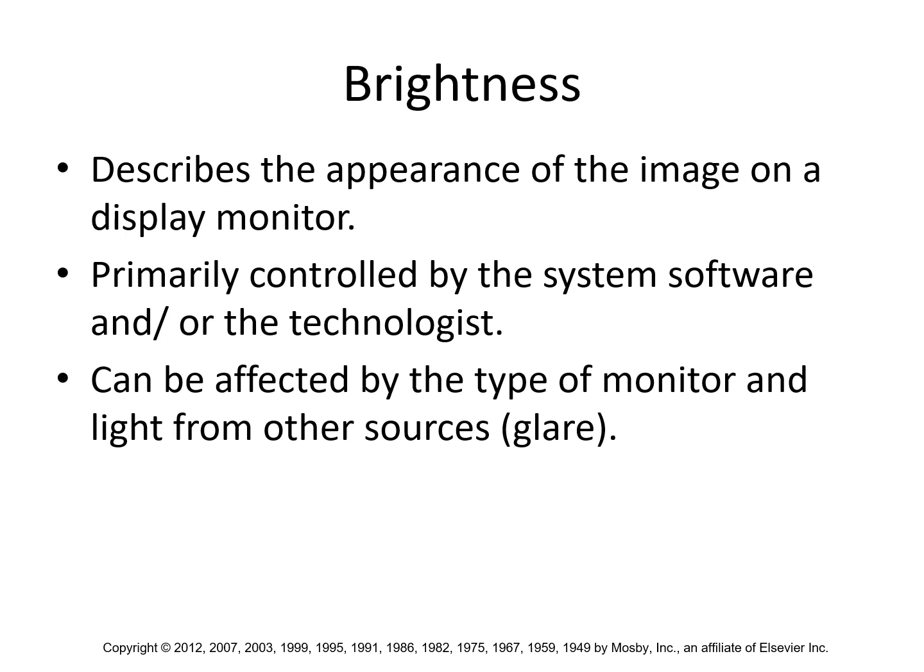So the software function for that is called window width and window level. Window width changes your contrast. Window level changes your brightness or your darkness. Okay, if you increase window level, the image will get overall darker. If you decrease window level, the image will get brighter. Okay? If you increase window width, then there'll be more shades of gray on your image. If you decrease window width, your contrast will improve. That'll mean the differences in colors will be greater. You'll have a shorter grayscale on the image. Okay?